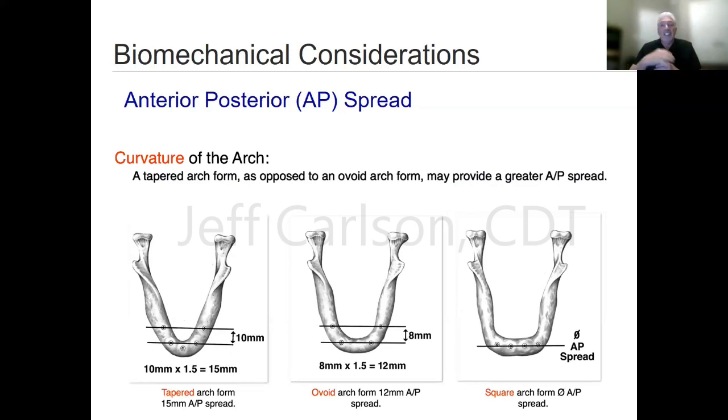So it's not just the tooth going back. My occlusal table ends 12 millimeters from my terminal implant, yet I have a 5 millimeter flange extending back here, maybe up under the retromolar pad, and that patient can bite down. That cantilever goes all the way back to that. So please keep that in mind as well.